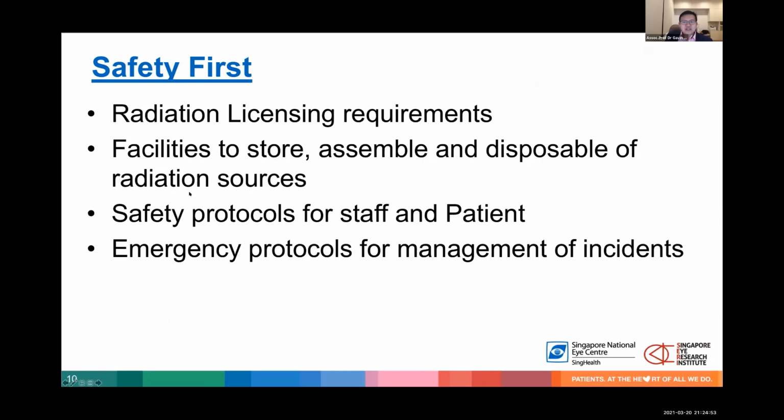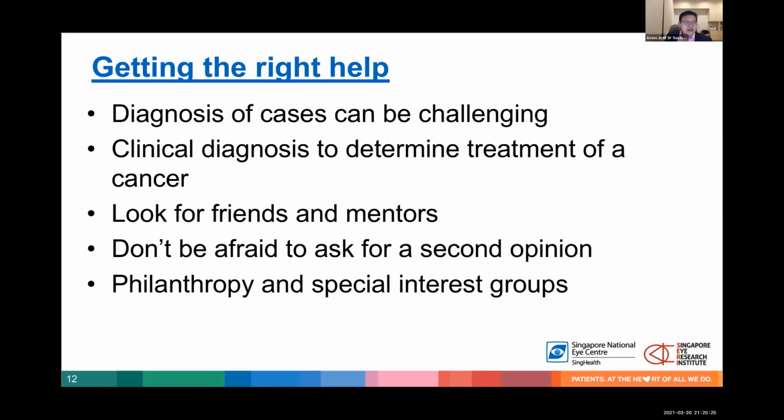And when you actually go about doing it as ophthalmologists, you really need to figure out and navigate certain things which you can't do without the physicists and the radiation oncologists, whether it goes to radiation licensing requirement, facilities to store, assemble, and dispose of the radiation sources, all the safety protocols that need to be developed, and also emergency protocols for the management of incidents. Somebody asked in the Q&A what happens to patients who may, for example, die while the plaque's in situ. You need to have protocols to manage this. And of course, it is not going to be easy. You really need to get the right help.